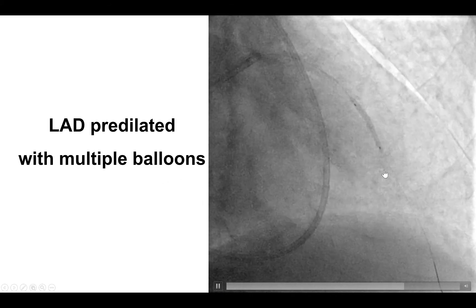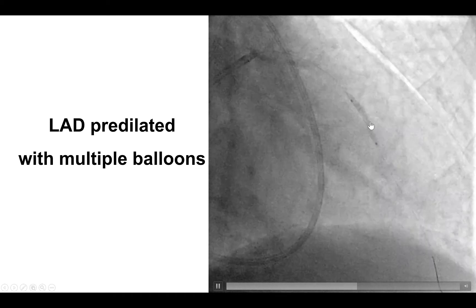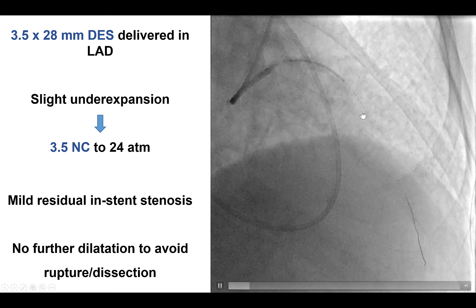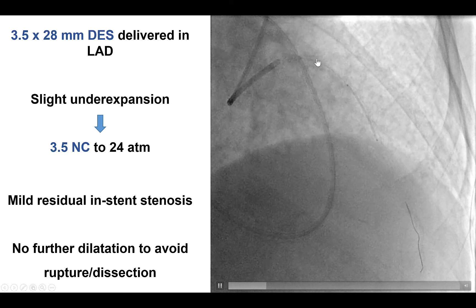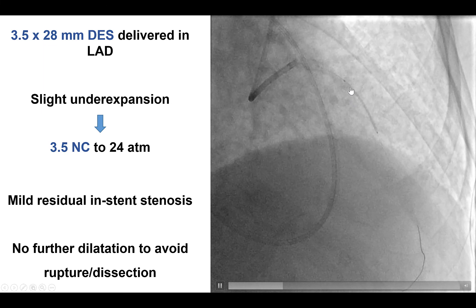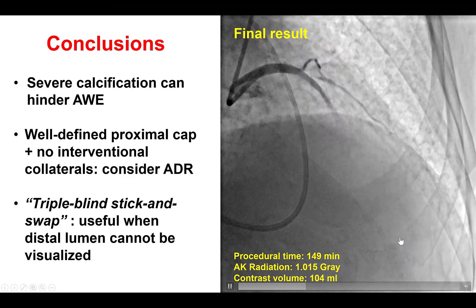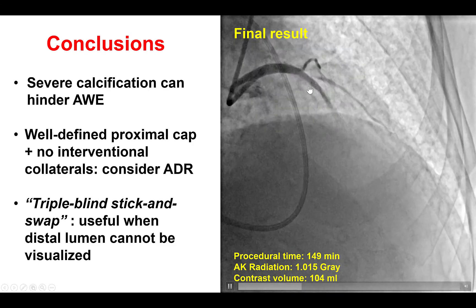After confirming true lumen position, the Pilot was changed for a workhorse guidewire, the LAD was pre-dilated, and then stented with a drug-eluting stent that was also post-dilated at high pressure. Retrospectively, atherectomy might have helped ensure better expansion given the severe calcification. An adequate result was achieved with TIMI flow down into the LAD, though there was some under-expansion within the LAD stent.